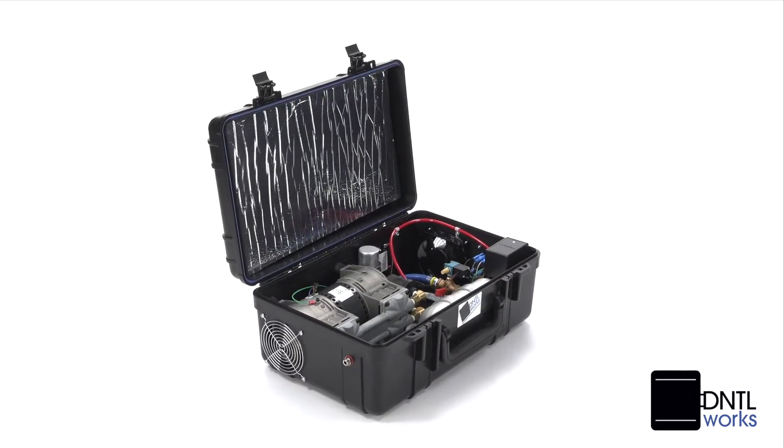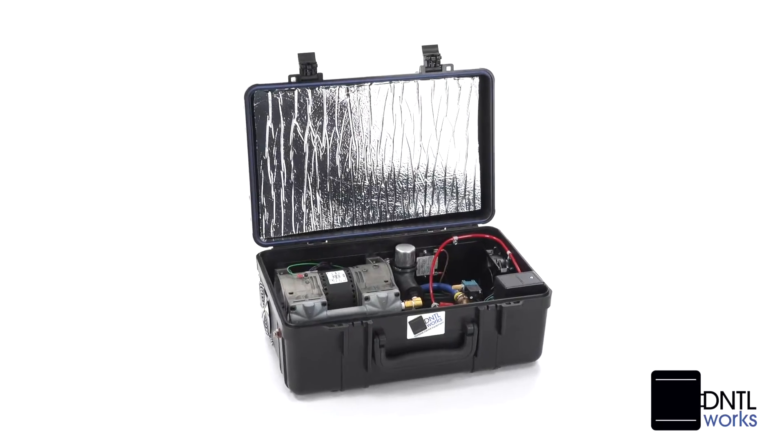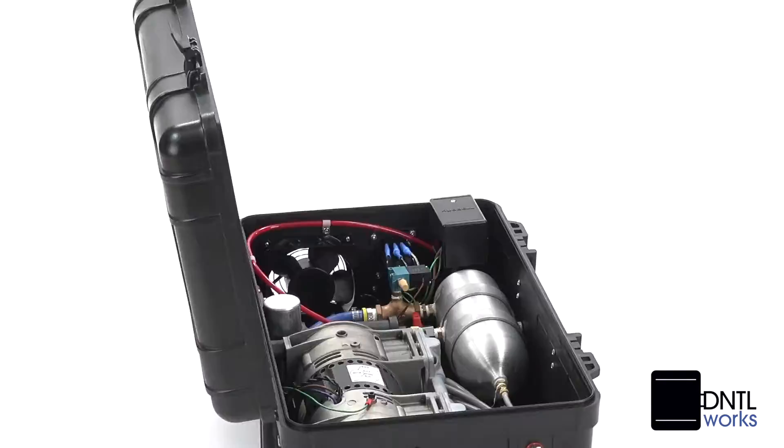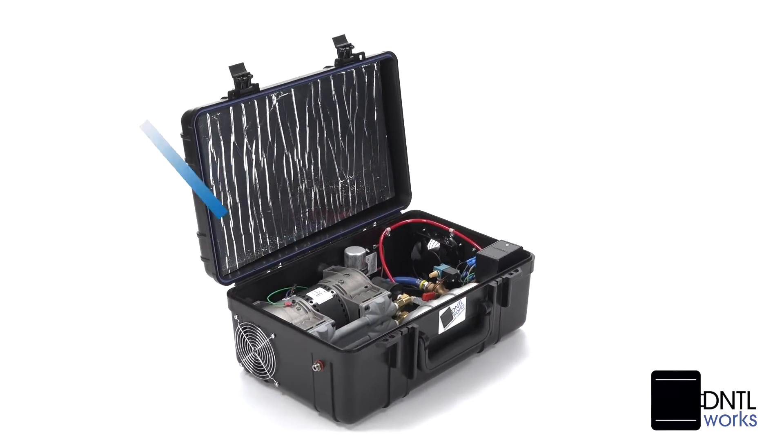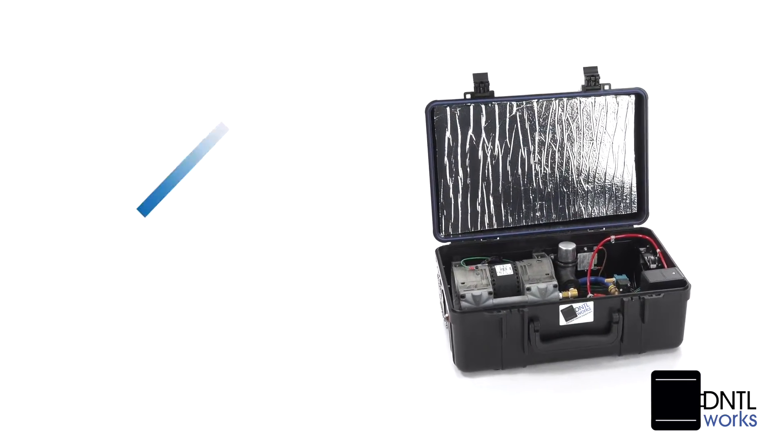We incorporate high-quality American made components into all of our designs. Our attention to detail and ability to custom build quality products provides dental professionals with both economic benefits and a perfect fit to meet their needs.